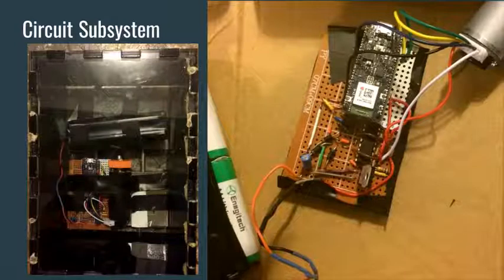Unfortunately, there's no way to restart the device, so the patient would have to call their orthodontist, inform them of the malfunction, and the orthodontist would have to replace the expander in the patient by removing the current expander and replacing it with a new one that functions.